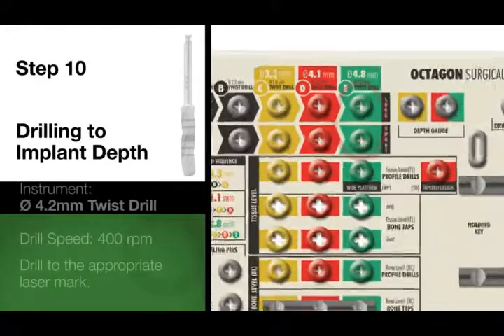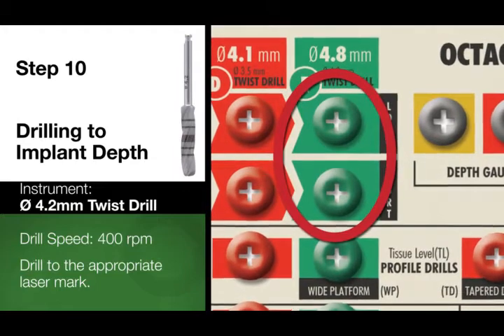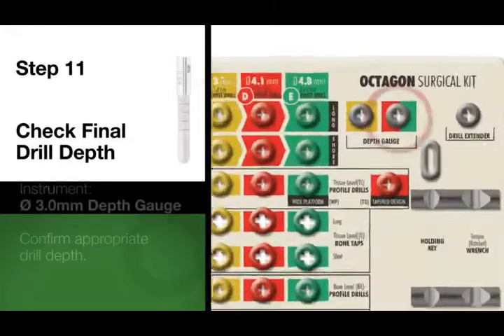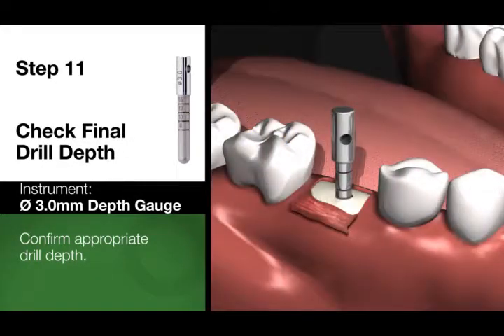Step 10. Using the 4.2 mm twist drill, identify the laser marking matching the length of the implant you will place. With a motor speed of 400 RPM and copious irrigation, drill to the appropriate depth. Step 11. Using the 3 mm depth gauge, confirm the depth of the osteotomy matches the implant length.